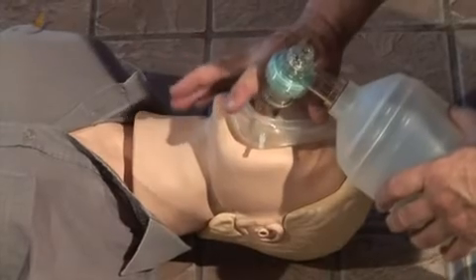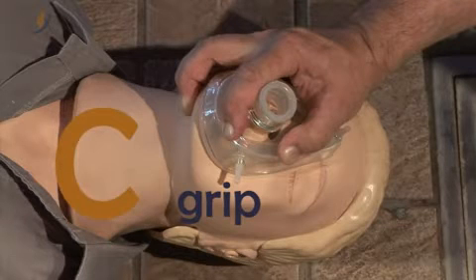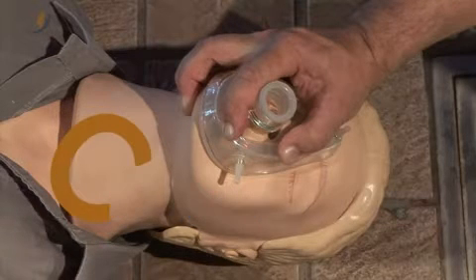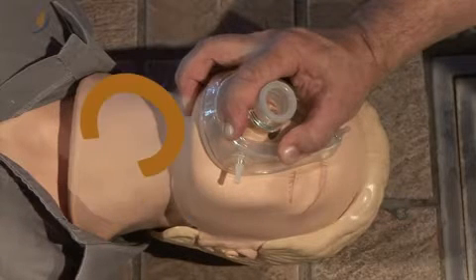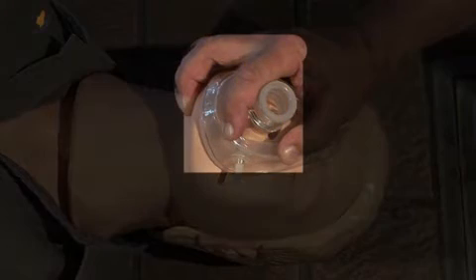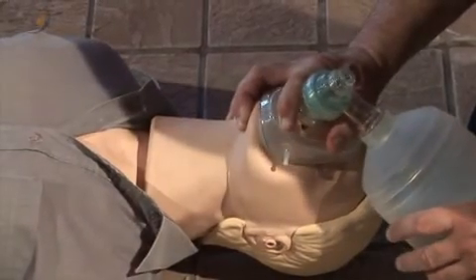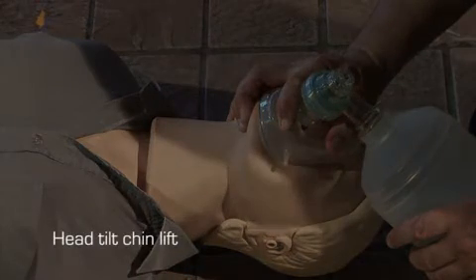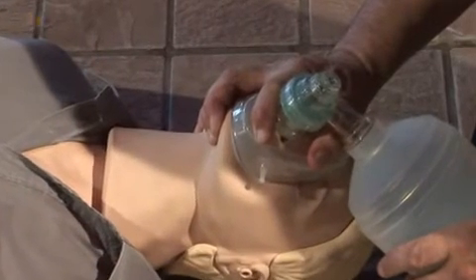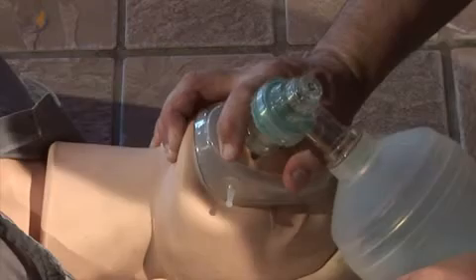The practitioner kneels above the patient's head. He or she seals the mask by using the C-grip on the mask with the thumb and index finger, placing the remainder of the fingers on the jaw. Open the airway as normal using a head tilt chin lift.